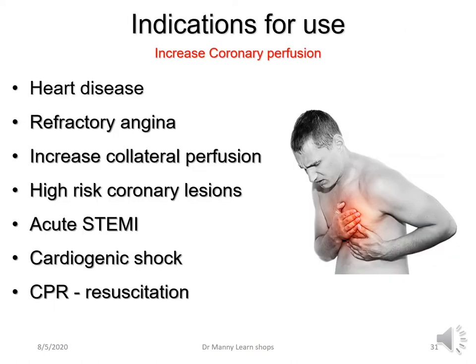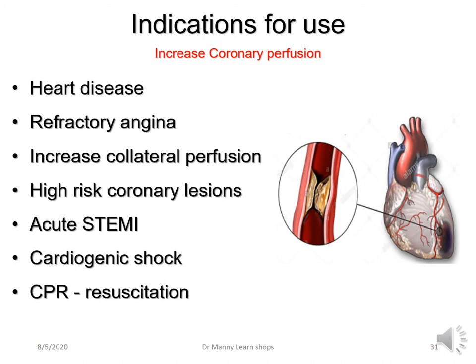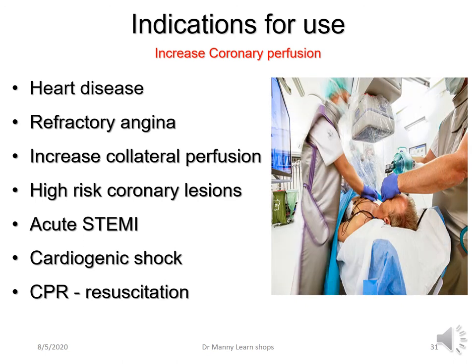So what are the indications for use? The indications for use are primarily to increase coronary perfusion in patients with heart disease, refractory angina, to increase collateral perfusion to the myocardium that's being affected, high-risk coronary lesions, acute ST segment elevation myocardial infarction, cardiogenic shock, and even during resuscitation, cardiopulmonary resuscitation.